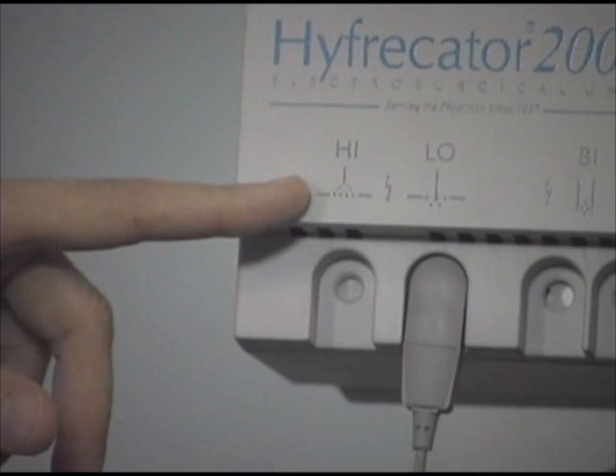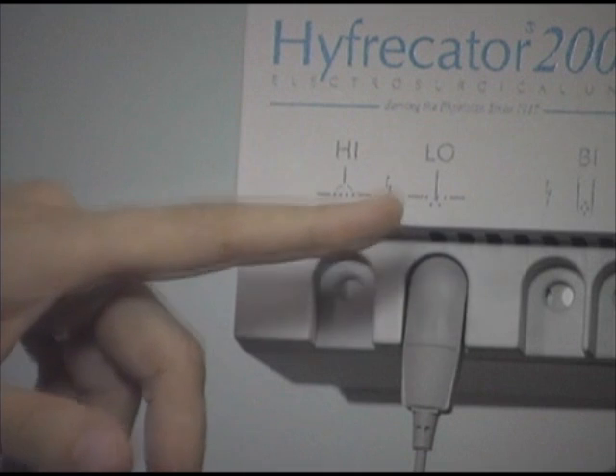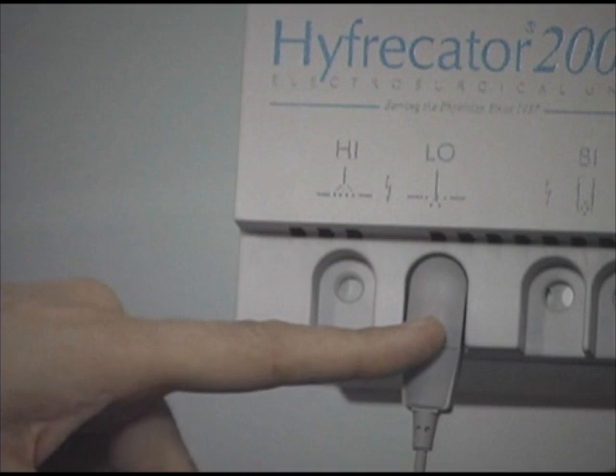In this program we will provide suggestions about which power settings to use. The power settings are measured in watts and visible on this instrument. If you are not sure where to start, begin with low power and increase the power until you get the desired effect. In general, the power setting needed for coagulation is higher than the setting for tissue destruction. The use of too much power may increase scarring. The Hyfrecator has high and low terminals. All the procedures we will be demonstrating will be performed with the low output terminal and the sharp tip electrode.